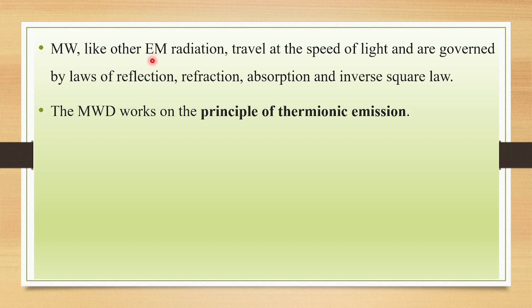Microwaves, like other electromagnetic radiation, travel at the speed of light and are governed by the laws of reflection, refraction, absorption, and inverse square law. Microwave diathermy works on the principle of thermionic emission.